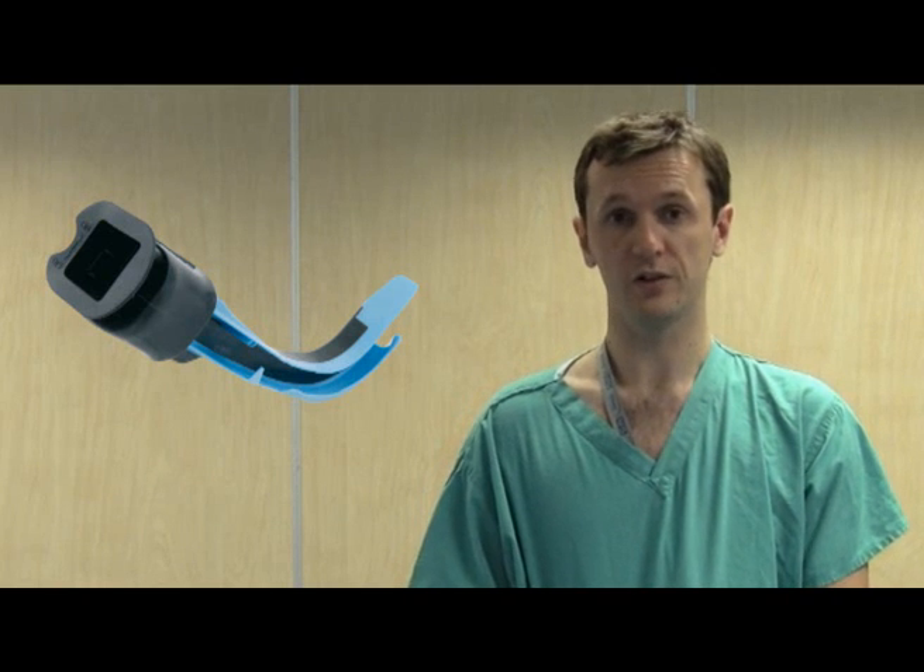Now we'll move on to our final laryngoscope, which is called the Airtrack laryngoscope. The Airtrack is very different to the Macintosh, the C-Mac, and the AP scope. Like before, I'll perform a silent run-through first, and then we'll take you through laryngoscopy with the Airtrack step by step.